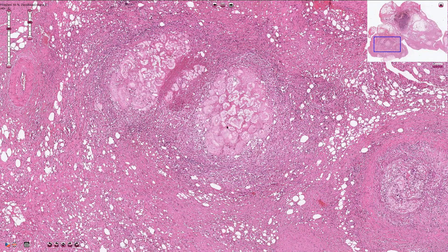Here we have some other foci of fat necrosis with prominent fibrotic reaction in the adjacent tissue.